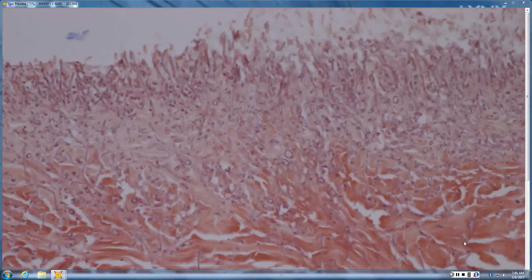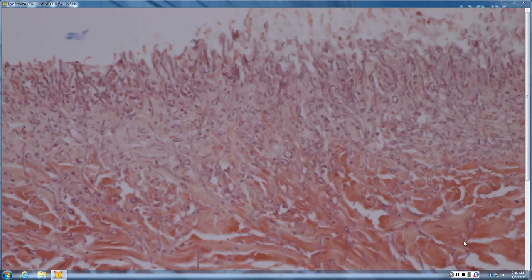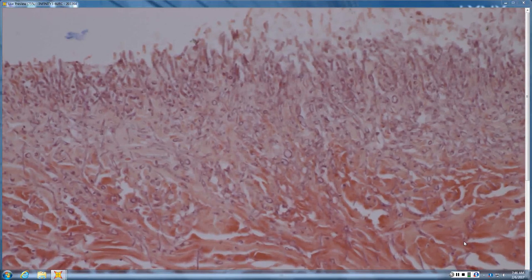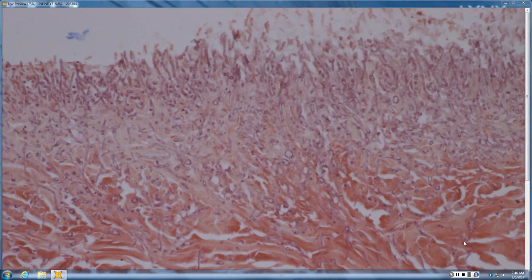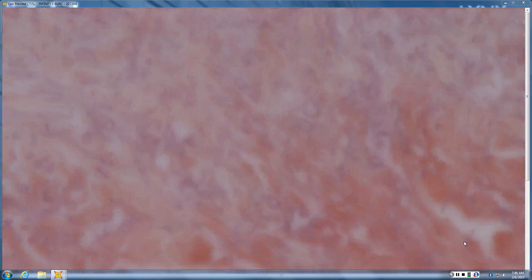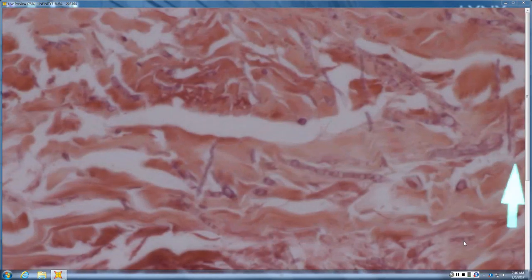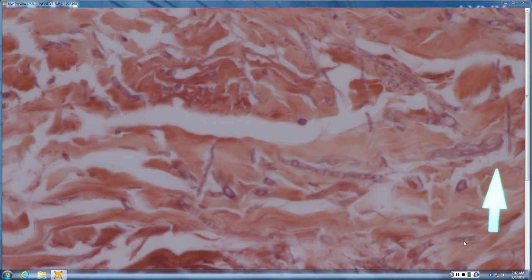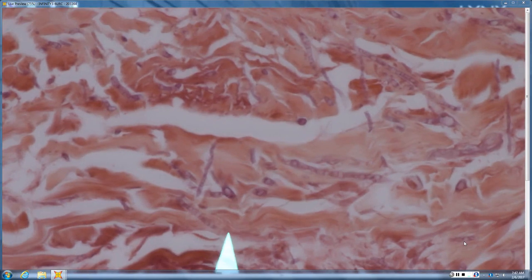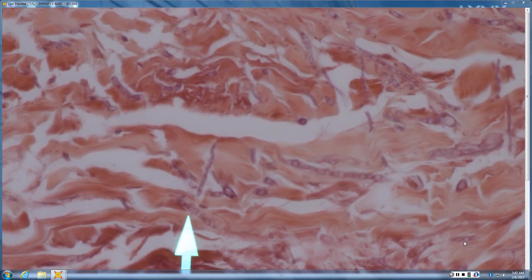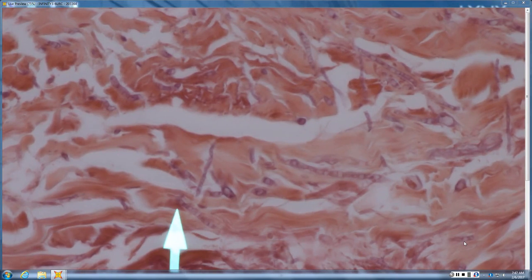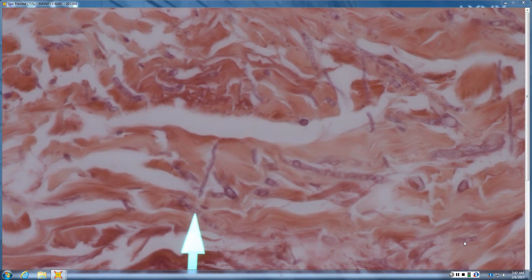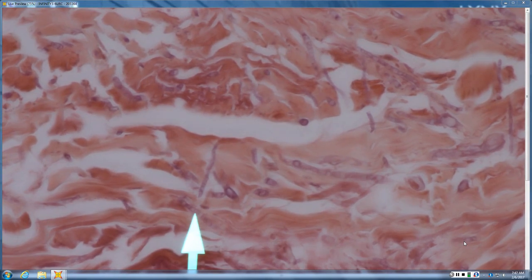So, maybe it looks like some vertically oriented. So, vertically oriented, but they're not just in the corneum, right? They're in the tissue as well. And when you look at them, Paige, do you see mainly a cell, a refractile cell wall at the edge, or do you see mainly bubbly cytoplasm in the middle? Bubbly cytoplasm in the middle?